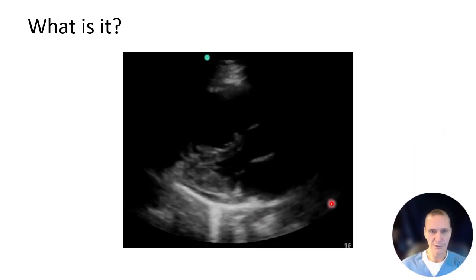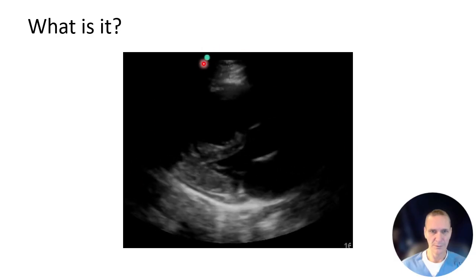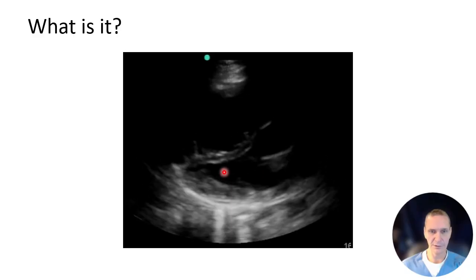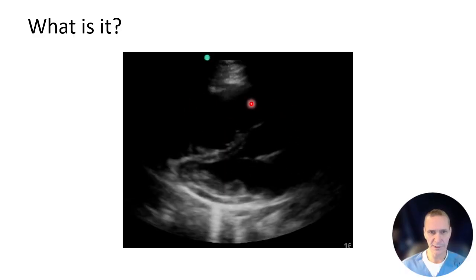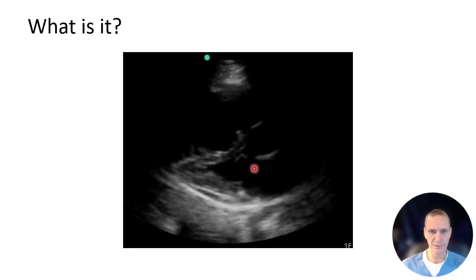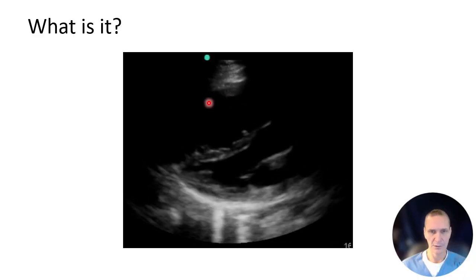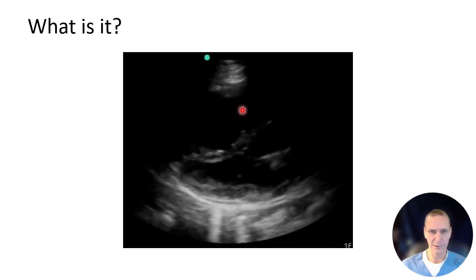This is a parasternal long axis view, in abdominal mode. I see the LA going into the LV. The LV appears underfilled. This is the aortic outflow tract. And what really stands out is the right ventricular outflow tract is large. Remember the rule of thirds. This should be equal to this, should be equal to this. The right side is significantly dilated.